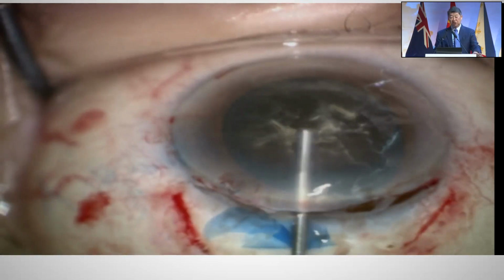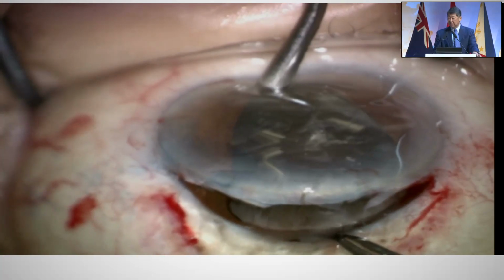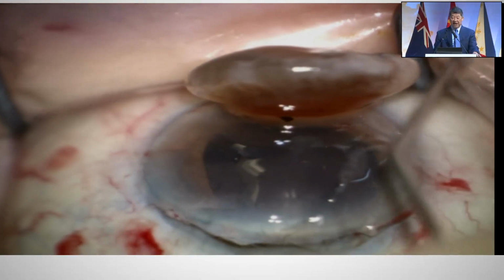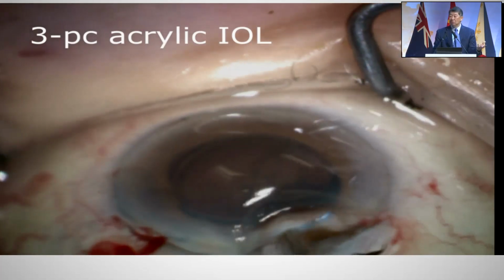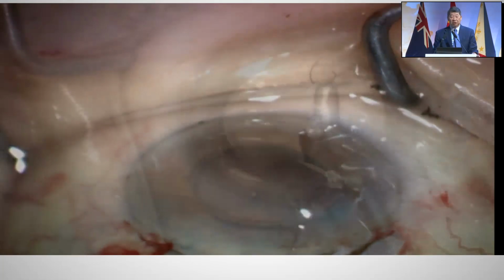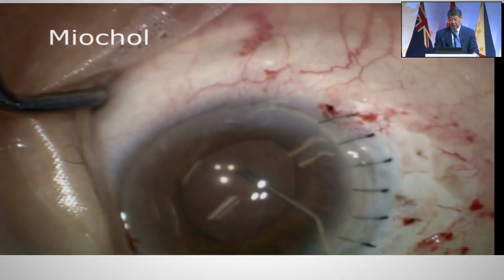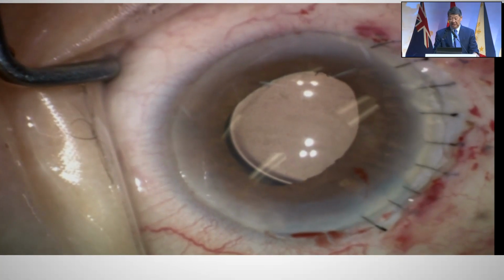Well, this is going to be much better for the cornea, and certainly we can preserve the posterior capsule so we don't have retained lens. Also, I'm not going to have to suture fixate the bag with some kind of sutured element, because this lens is a three-piece, and one of the haptics is probably going to end up in the sulcus, and this will never dislocate. So I've got great fixation. The only thing is I have some sutures in an eye that had horrible preoperative vision to begin with. So this is an underutilized technique, in my opinion.